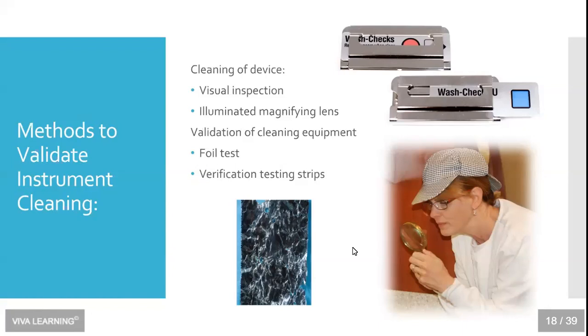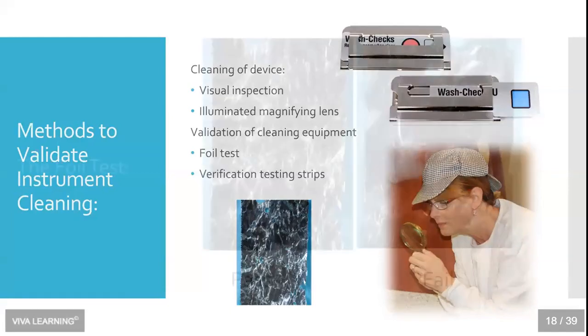Also, there is validation, and that's what I'm about to talk to you about right now. Number one is the foil test, and number two, verification testing strips. And I'll go into greater detail in just a second.